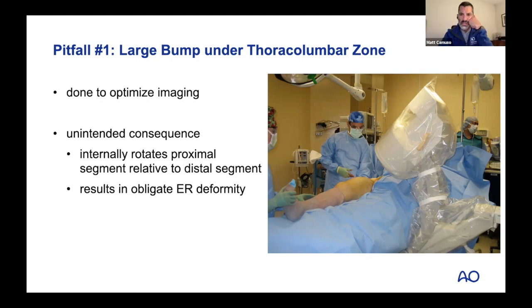Yeah, I think once the nail is in, then it's easy. You don't need it anymore. And so the starting point's been effectively established. The nail's in, so you don't really need it anymore. I love that trick. In fact, I'm going to use that, using a handle to be able to take it off. So they don't have to go underneath the drapes to get it out for you, because they're obviously very annoyed by that. They wouldn't do it for me.